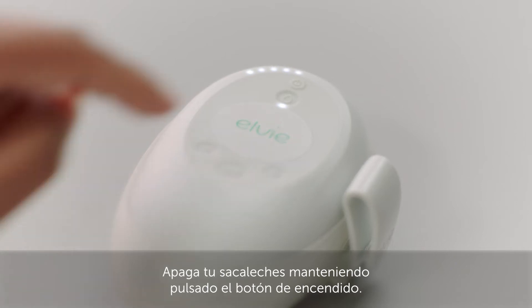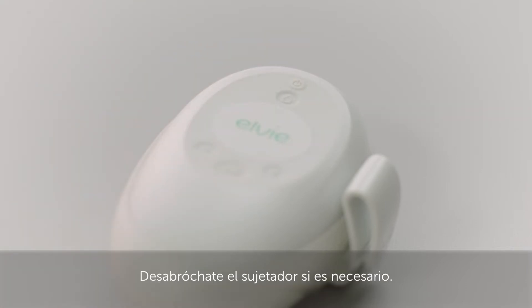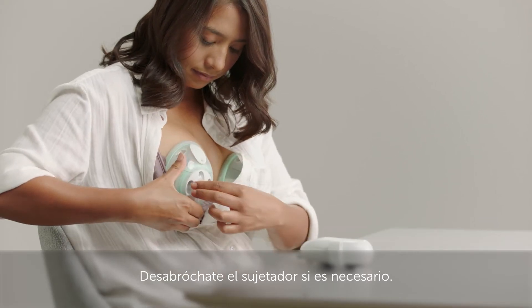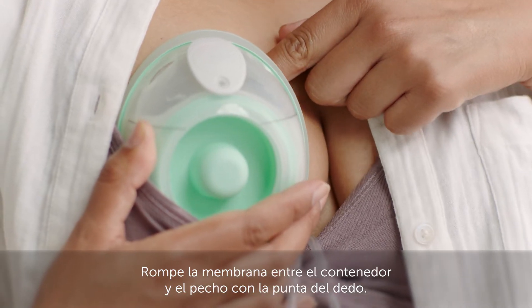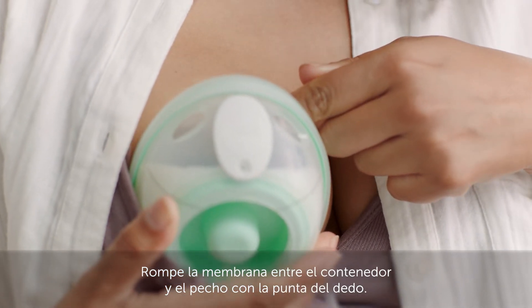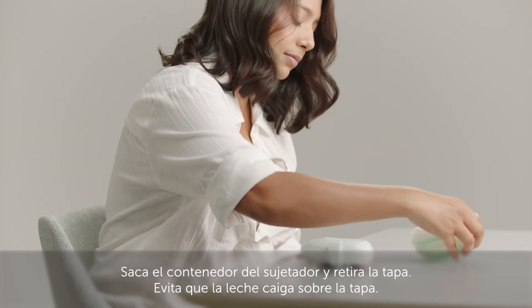Turn off your pump by pressing and holding the power button. Unclip your bra if you need to, remove the caps, and break the seal between the cup and your breast using a fingertip. Take the cup out of your bra, avoiding getting any milk on the caps.